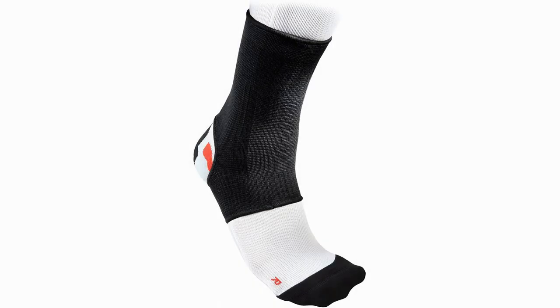McDavid 511 Compression Ankle Support. The McDavid 511 is a very basic ankle sleeve made of breathable, non-neoprene elastic. This is a great recovery ankle brace from injuries such as a severe ankle sprain, or even something more severe such as a broken ankle.